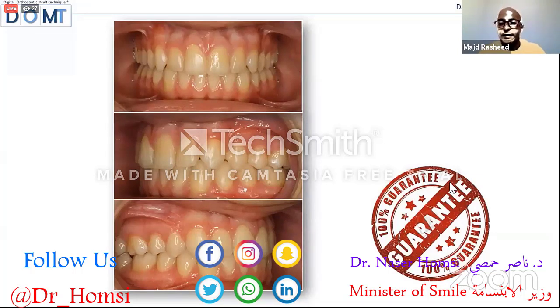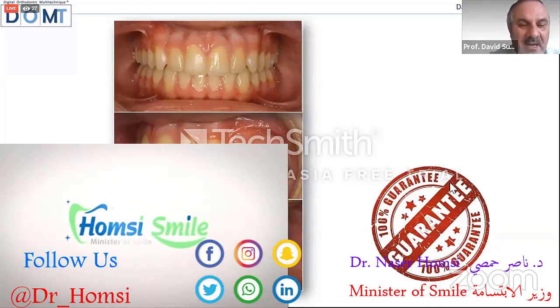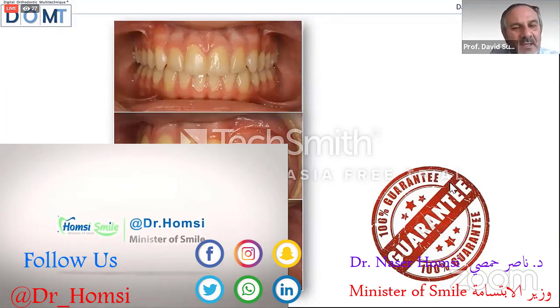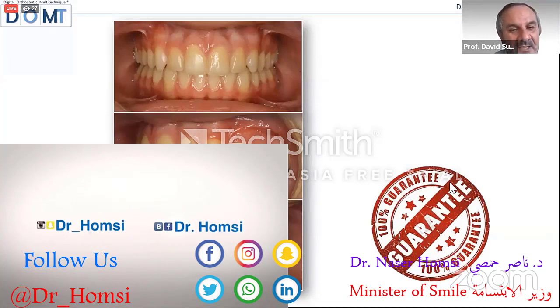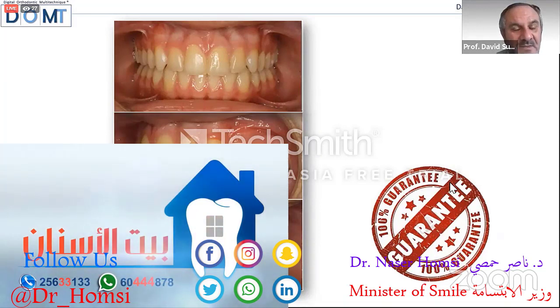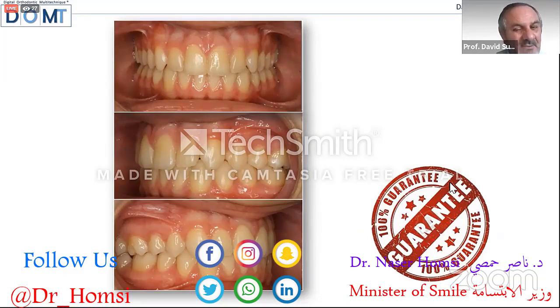Now, regarding the clear aligners, which age do you prefer to start in for children? And do you manufacture it in Europe? No, I don't manufacture. This is manufactured by a company in Spain, in the city of Malaga. The name is Alinea Dent. I don't have experience manufacturing the aligners at home, okay? Because the main problem with aligners at home is the price of the resin. It's not very easy to organize the aligners at home. Maybe in the future, depending on the price of the printing.